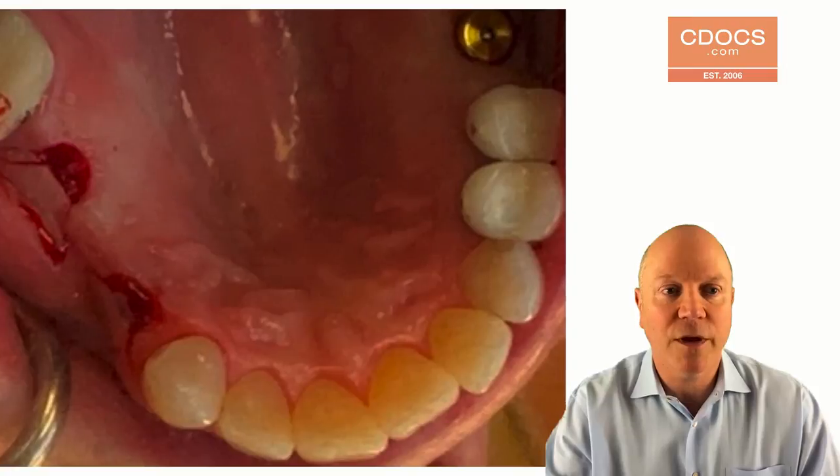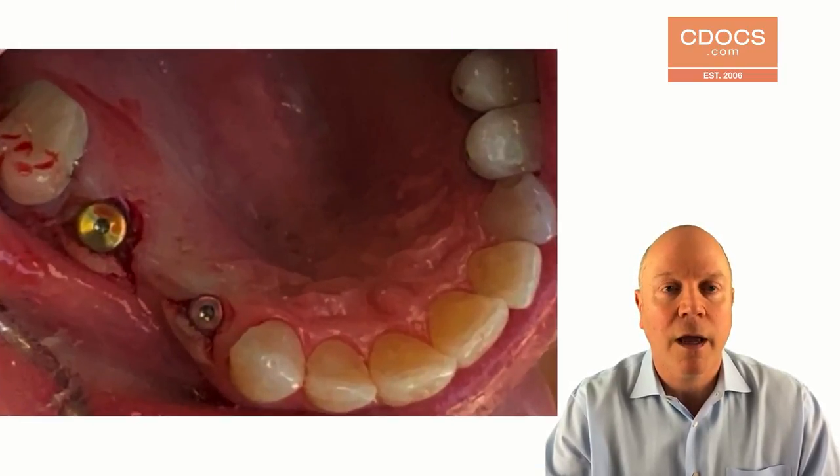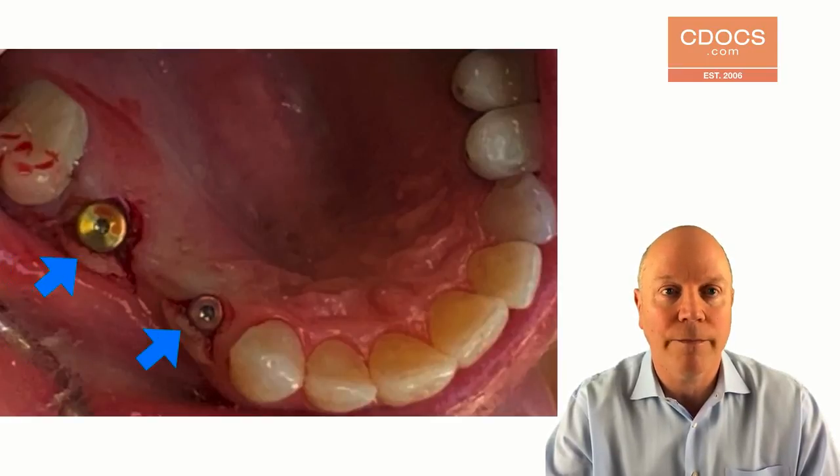Now you can see the flap's fully done, and I've taken the tissue punch and really cleaned up on the palatal there so it'll fit really nicely when I put the healing cuffs in. With the healing cuffs in place, look how much great thick keratinized tissue I have on the buccal. All really simple, very cleanly done, just because I used that surgical guide.